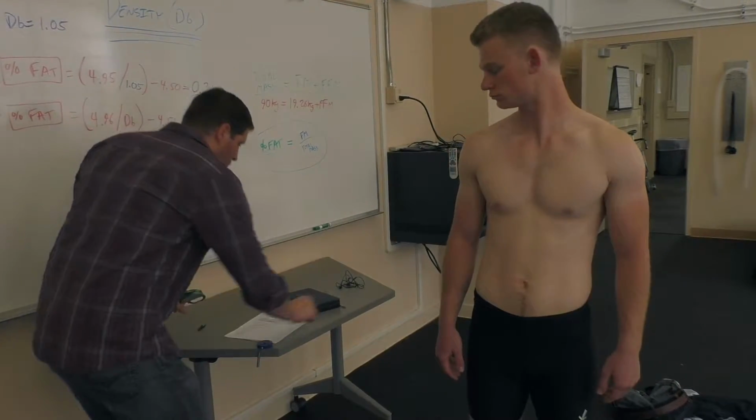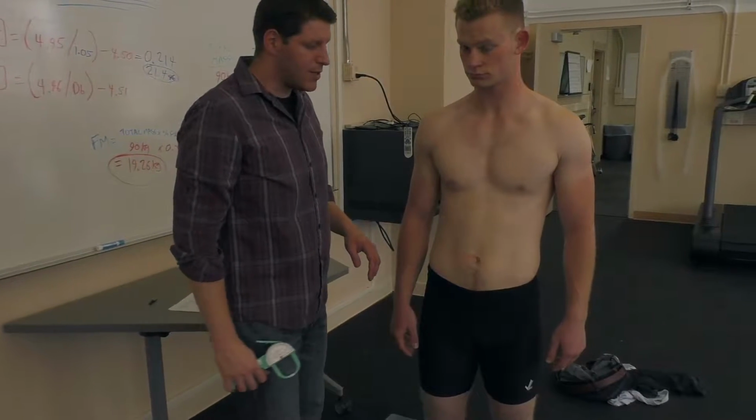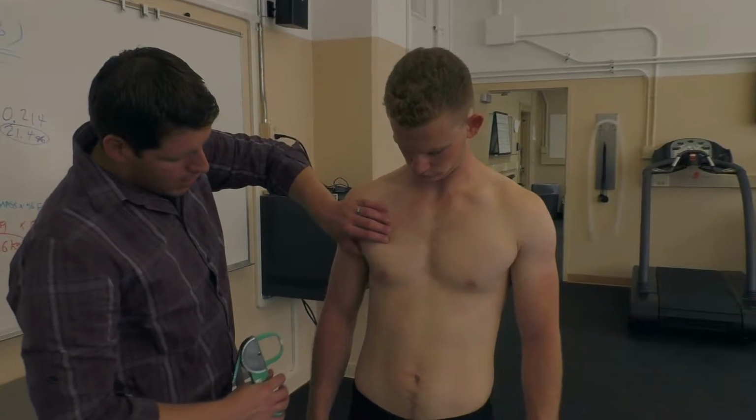So that was 11, so I'm going to go ahead and record that now. Always record everything you do. The next is the chest, which is halfway in between here and here, as you can see. So again, I'm going to reach down.